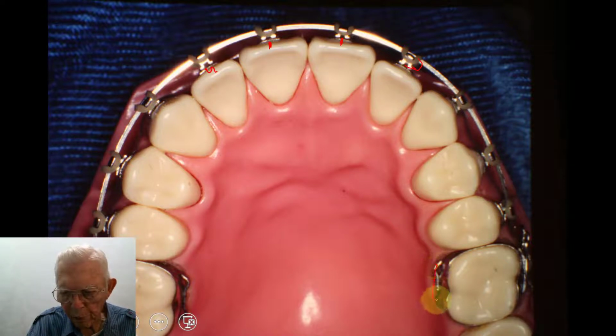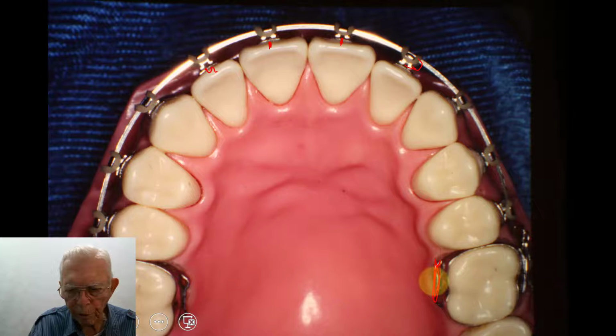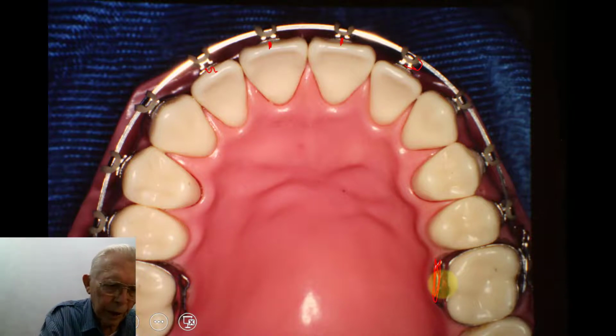On the top, we put a little cleat back here. You can attach things to the inside. On the bottom, you've got a little lingual button on that. And you've got a long inner bracket space.